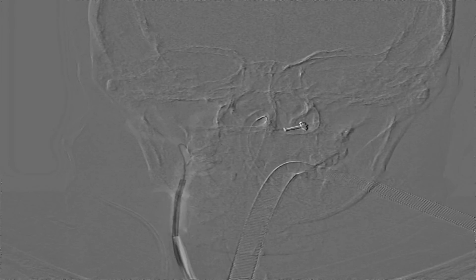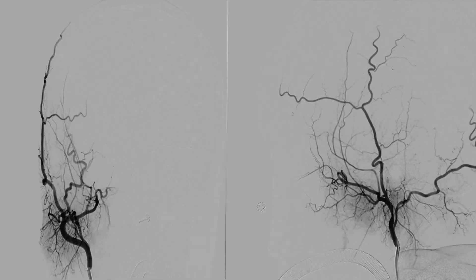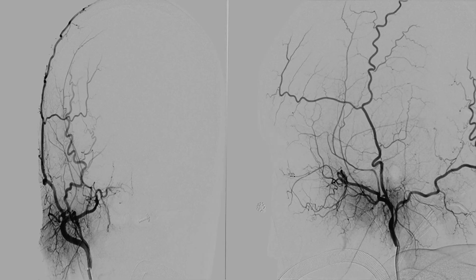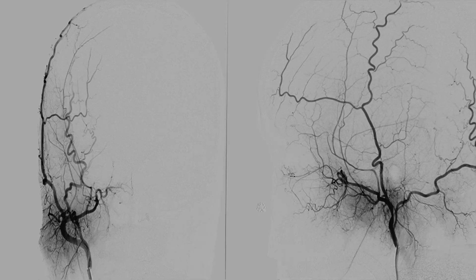For the external carotid artery, we withdraw our catheter back into the common carotid artery and again take a DSA of the common carotid artery for a roadmap. With the help of the roadmap, we advance the catheter over the wire into the external carotid artery and take a biplane DSA of the external carotid artery.